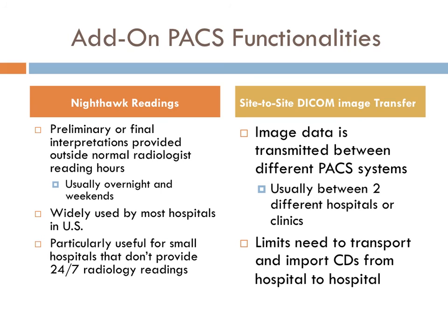Okay, so when a PACS is implemented at a site, new functionalities are often used. So one of them, Nighthawk readings. I am sure some of you have worked off-hour shifts where it's basically at a medium to small hospital where a radiologist is not on site to read all of the studies.